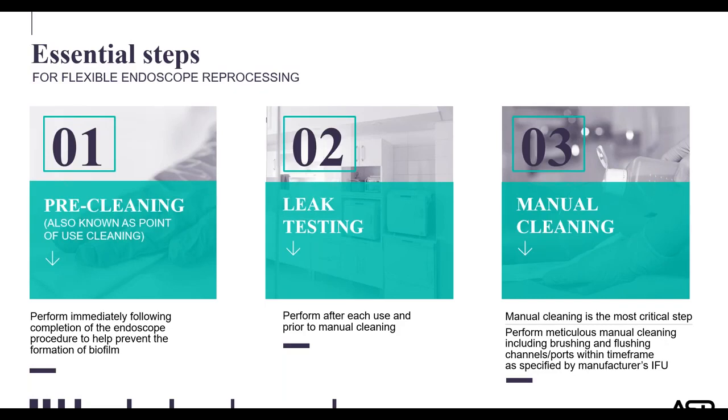So one of the technicians was doing a quality improvement project and noticed that the air coming from their leak tester seemed kind of faint. So he called on a couple of technicians who worked in the room every day, but they said, no, the air is adequate. That's how it is. He went to the manager and asked her to purchase a new leak tester. When they received that new leak tester, the air coming out was much more robust. And so they did find out that that device was actually indeed defective.